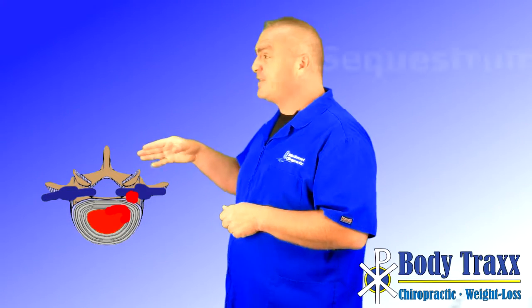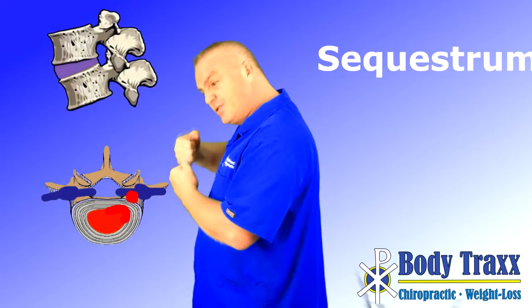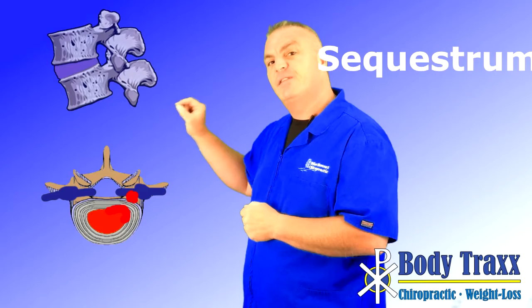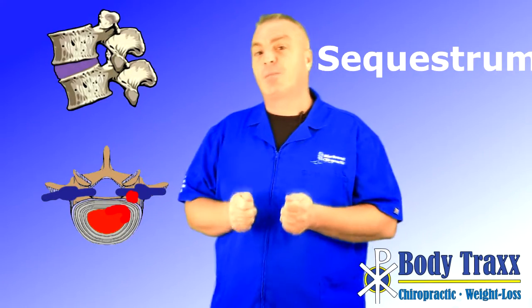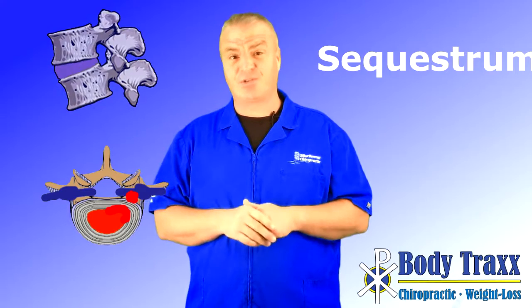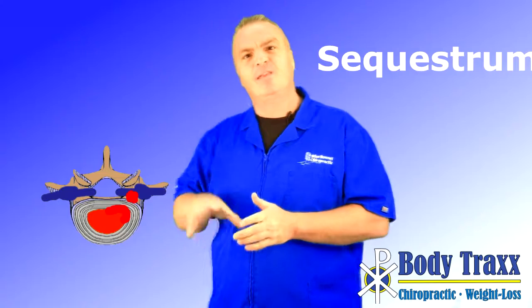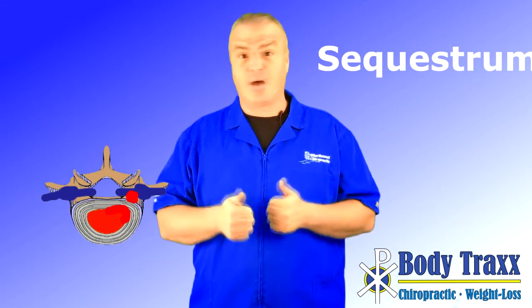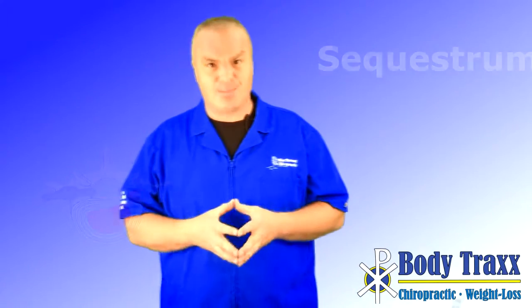Now, you can see on the last one, the disc is actually separated. And as we pull this apart and suck this in, you notice that other piece of the disc doesn't move with it. So if you have an MRI impressions page that says you have a sequestrum, I smile at you and tell you, I can't help you. This has gone too far. You're going to have surgery. If you're my mother, my brother, my sister, my kids, my wife, that is a surgical option.